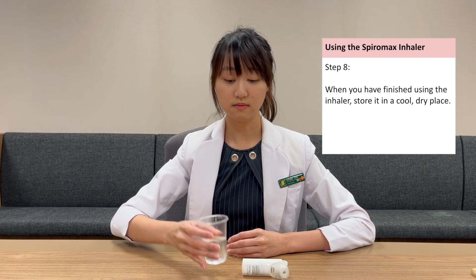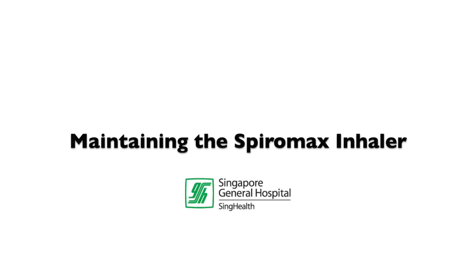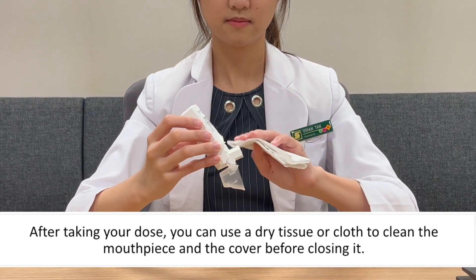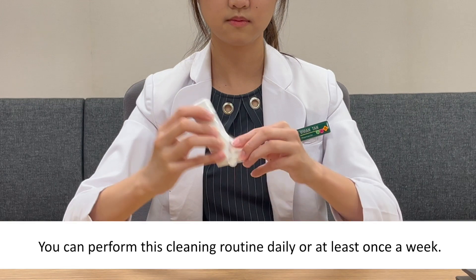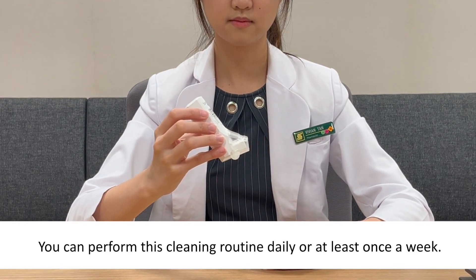When you have finished using the inhaler, store it in a cool dry place. After taking your dose, you can use a dry tissue or cloth to clean the mouthpiece and the cover before closing it. You can perform this cleaning routine daily or at least once a week.